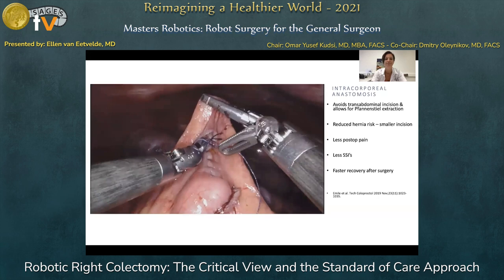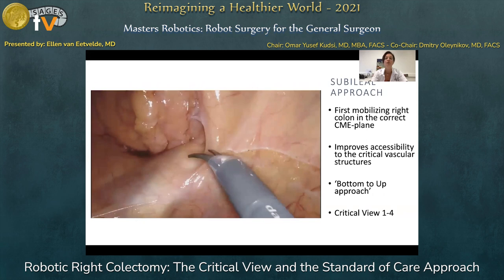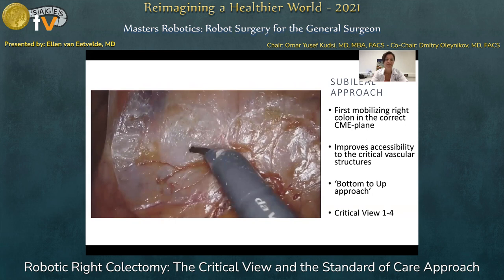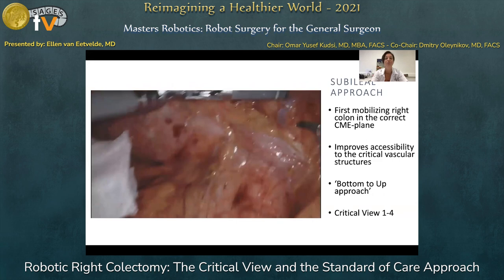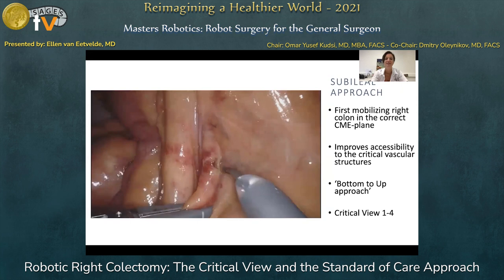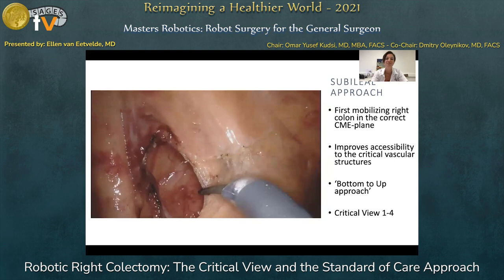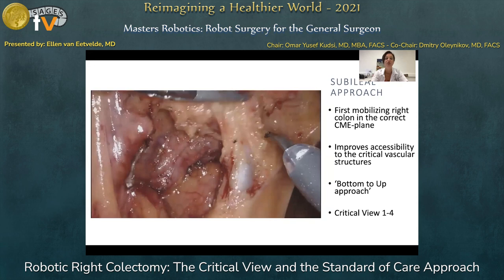The second thing you might want to switch is to the sub-ileal approach according to the critical view concept, where you open up the peritoneum at the sub-ileal region and separate both planes. We perform dissection over the duodenum and over the pancreatic head, and in slim patients you can even mobilize the hepatic flexure coming from below. We then go towards the ileocolic vessels in the V-view and dissect towards the superior mesenteric vein, performing a lymphadenectomy and then identifying the ileocolic vein and ileocolic artery.